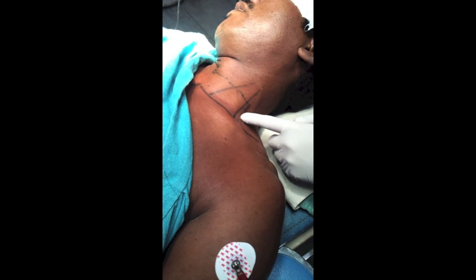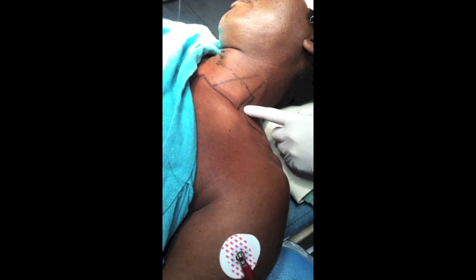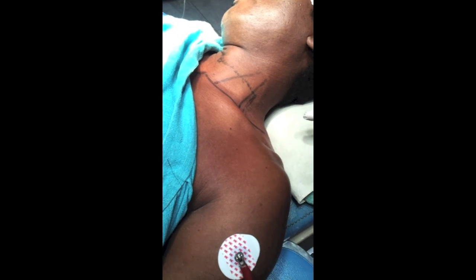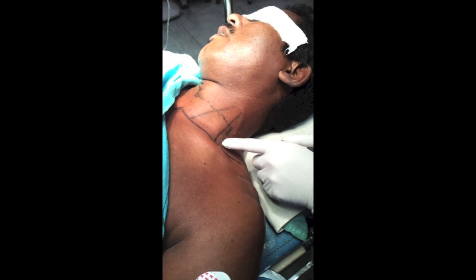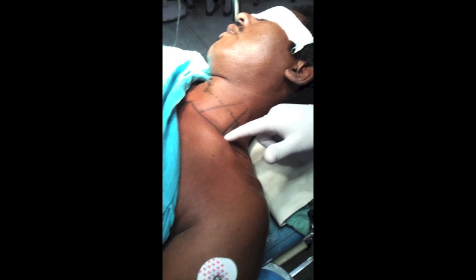Just above the clavicle — about two centimeters above — you can place the needle for mid-arm and elbow surgeries. At the base and just above the clavicle for distal surgeries like forearm surgery and wrist surgeries.